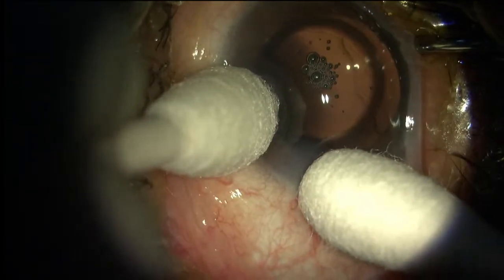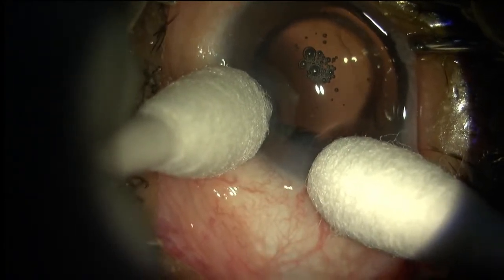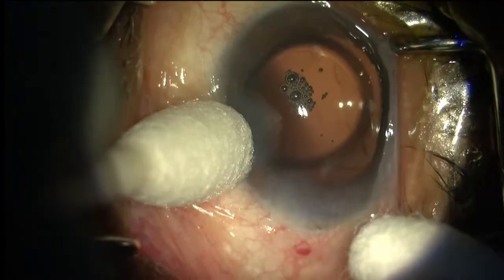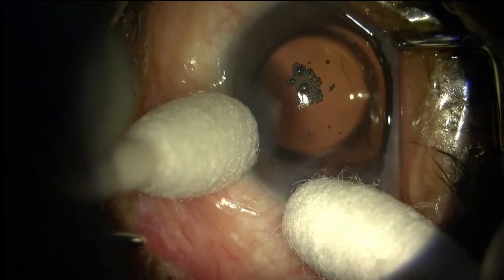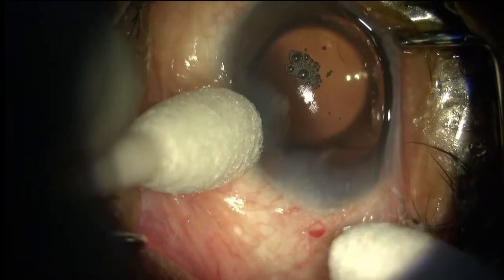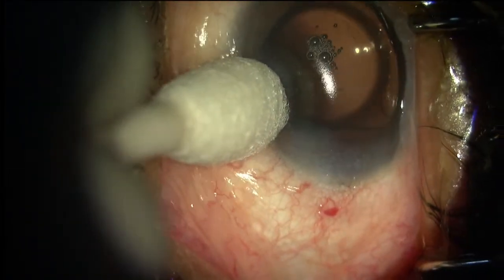And so this lens that way is very good because it has got no side effect and can still give very good vision, even in macular drusen, early ERM, where you want to really avoid the multifocal lens, but the patient still wants to have a reasonably good working vision. I think this lens serves that purpose very well.